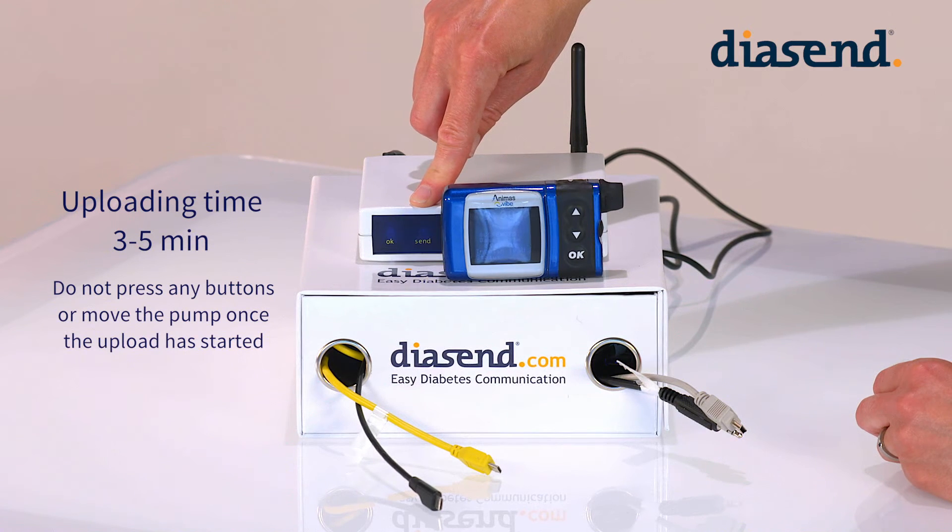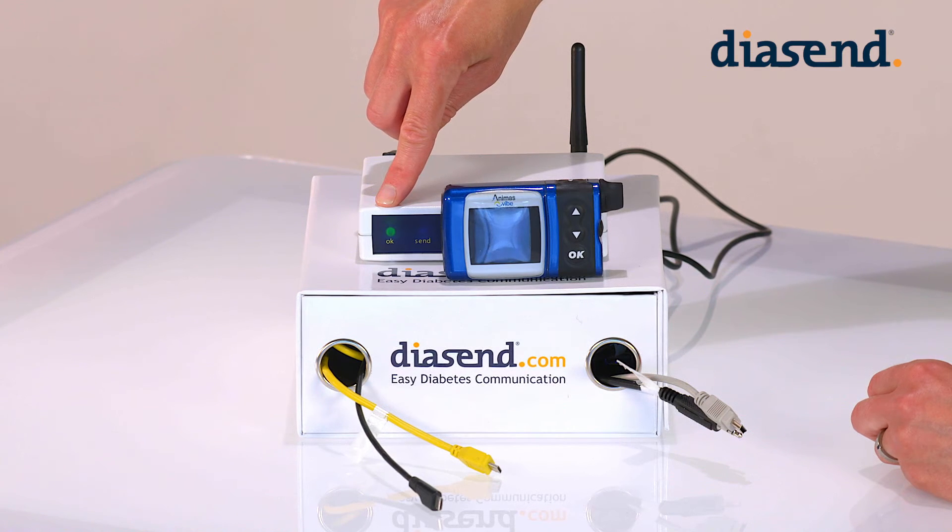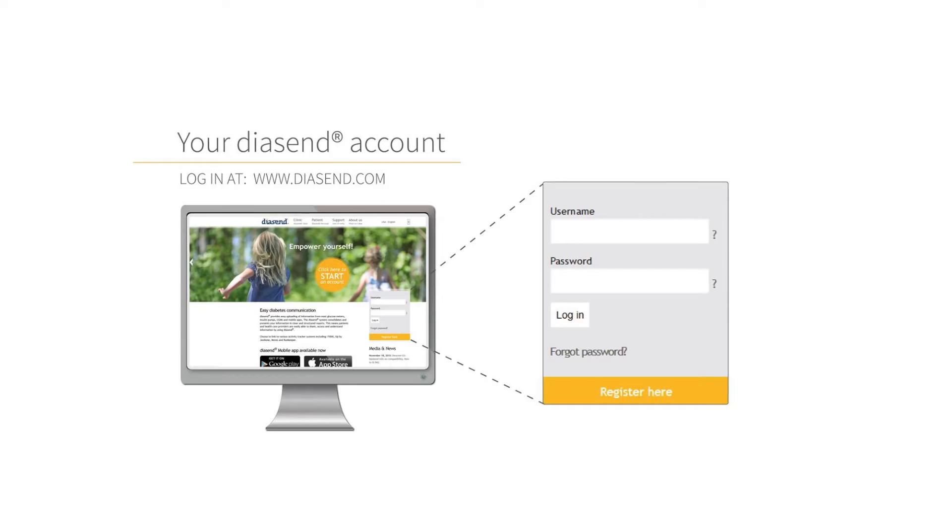There is no need to wake the screen up after it has started uploading. When the green light comes on, the device is uploaded and you can now view the data in Diacent.